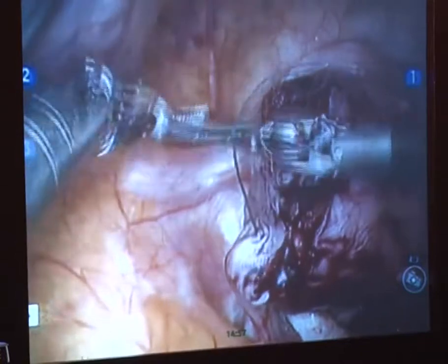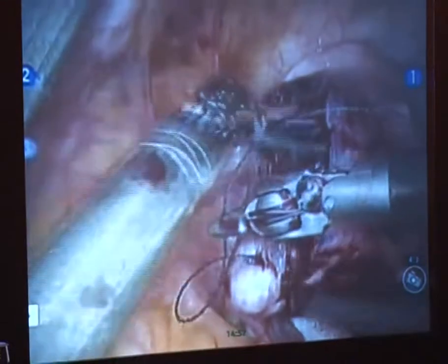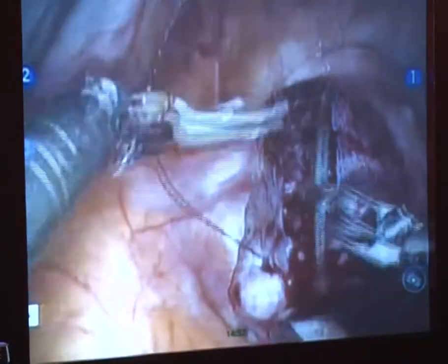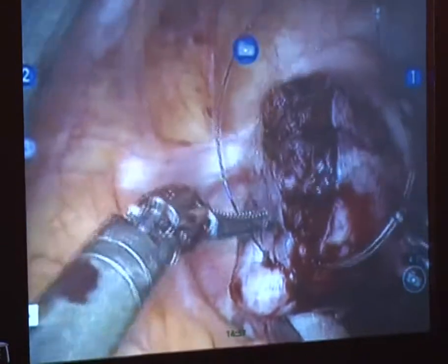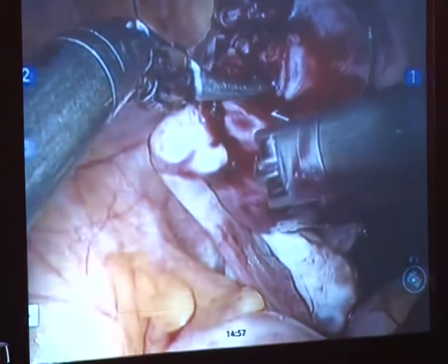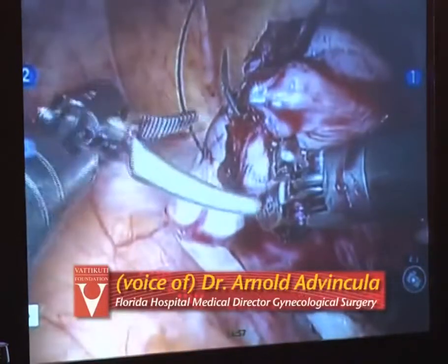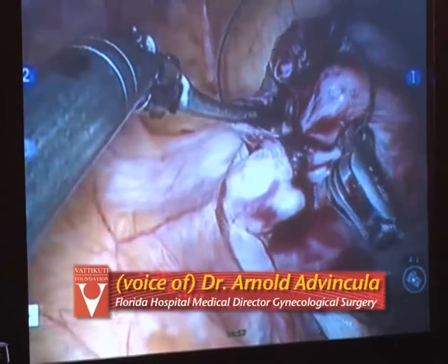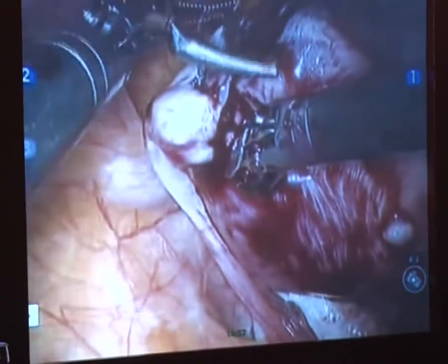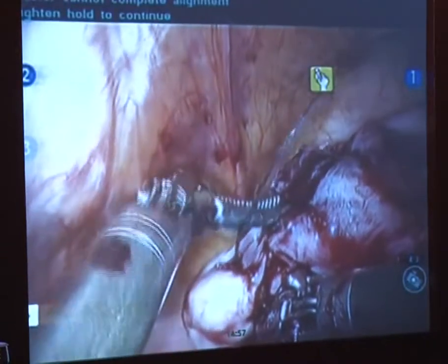Perfect. Arnie, I know you said that you're dealing with a petite woman, and most Indian women are petite, and we have our bigger ladies, which gives us the luxury of more real estate, as you said. But I think you got a little lucky today, because if you had the petite woman with a wide, broad uterus, that would have been a double whammy. So to have a uterus that's elongated versus broad, that's always easier. Oh, absolutely. Sometimes it's better to be lucky than good when you deal with certain patients. And so, yes, we may have had a petite patient, but the uterine shape was good for us.